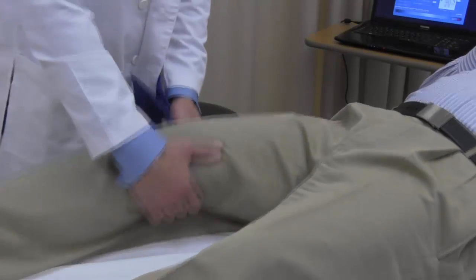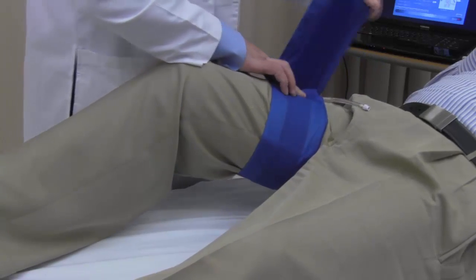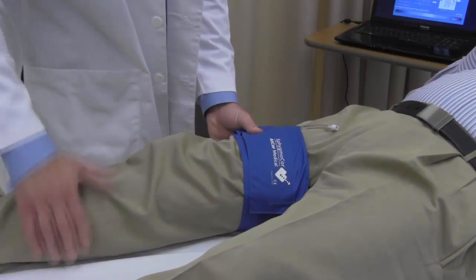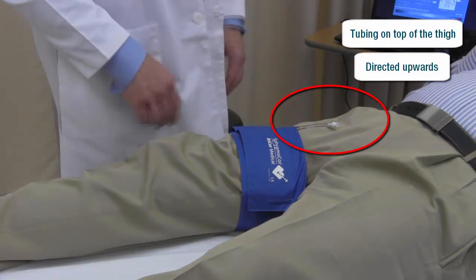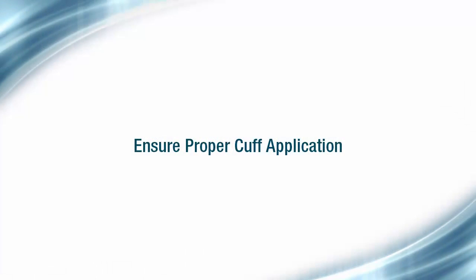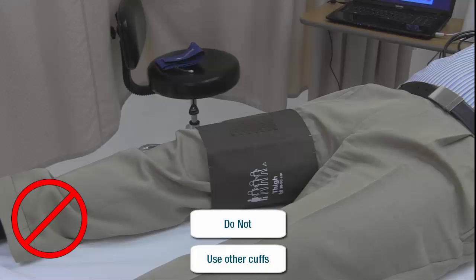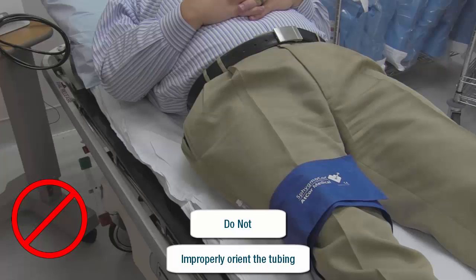Place the thigh cuff on the patient's leg as far up on the thigh as possible. The cuff can be placed over thin clothing, but in some instances it may be necessary for the cuff to be in direct contact with the patient's skin. Ensure that the tubing is on the top of the leg and directed upwards towards the patient's core. Proper cuff application is important for ensuring high quality data capture. Take caution to not use any other cuff, place the cuff upside down, or orient the cuff so that the tubing is anywhere other than the top of the thigh.